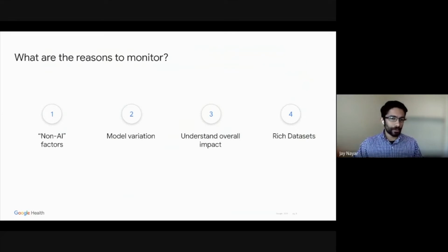Speaking about AI model variation, there is a naturally expected variation of model performance due to the inherent difference in how the model was trained versus the real-world patient population that it is seeing. A good model captures the essential patterns in the training data, which allows it to adapt properly to previously unseen data. But there are limitations to how well any model can generalize.